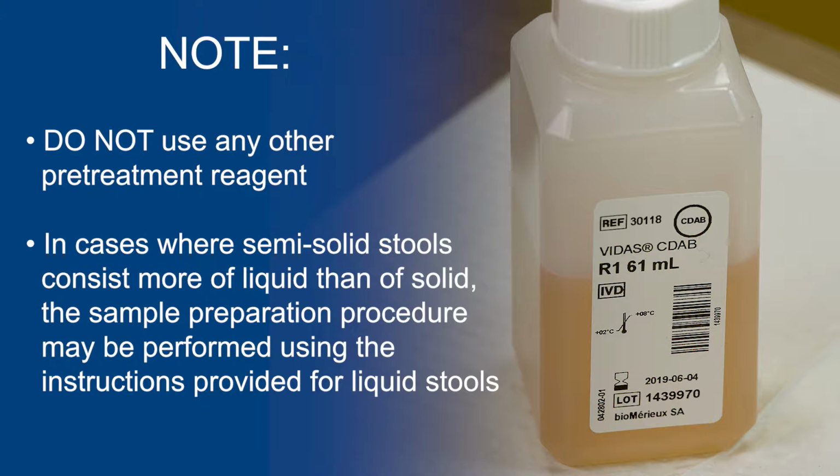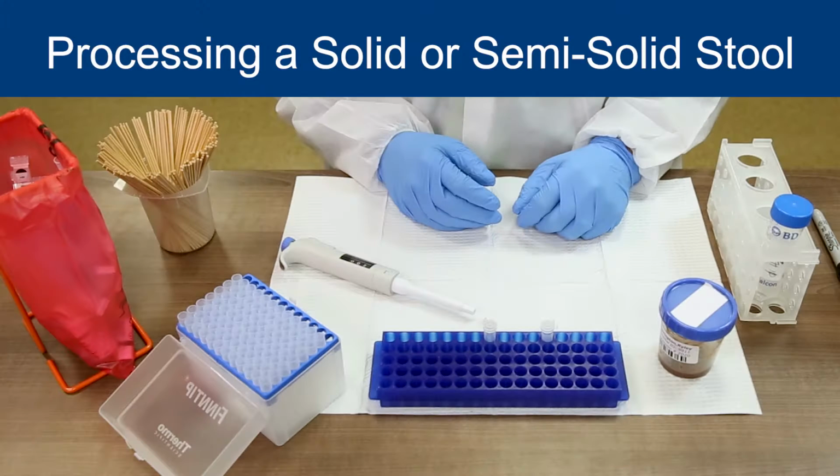In cases where semi-solid stools consist more of liquid than of solid, the sample preparation procedure may be performed using the instructions provided for liquid stools. If the specimen is solid or a semi-solid stool, process these specimens using the following steps.